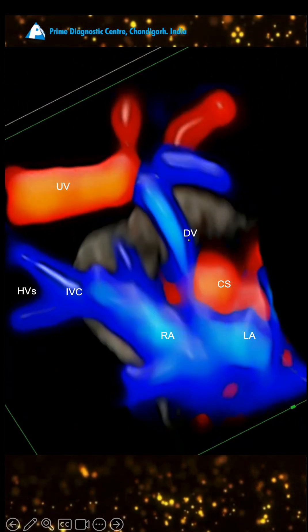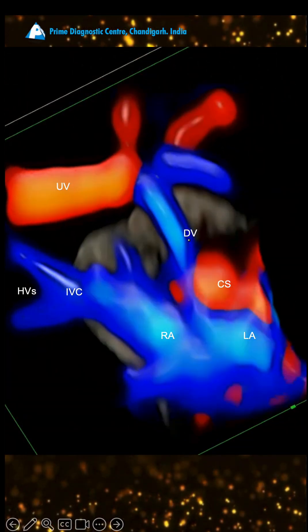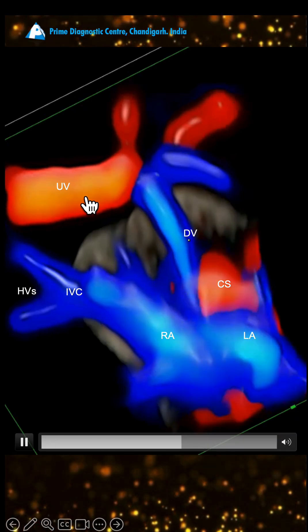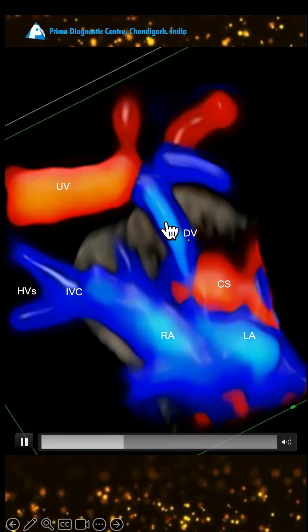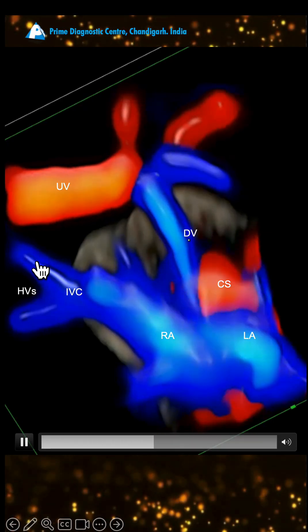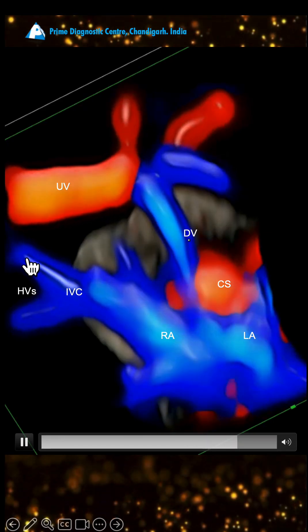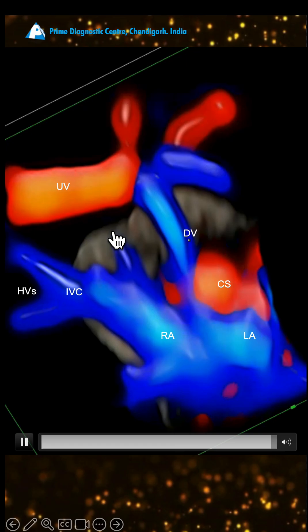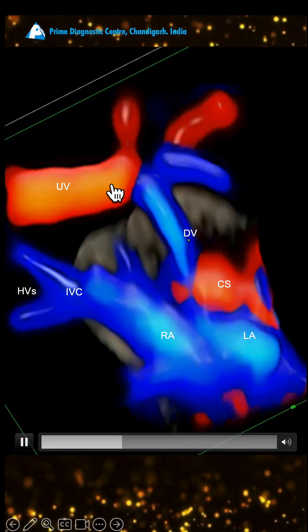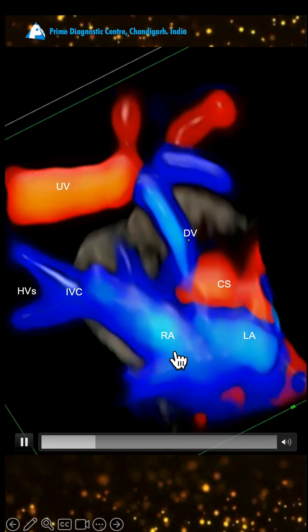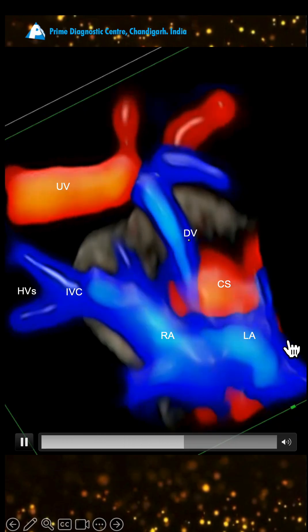On three-dimensional color Doppler you can see the anatomy clearly: this is the umbilical vein, this is the DV, and it is entering into the coronary sinus — while the hepatic veins and IVC enter into the right atrium. The umbilical vein through the DV is entering on the left side, while the IVC enters on the right side.